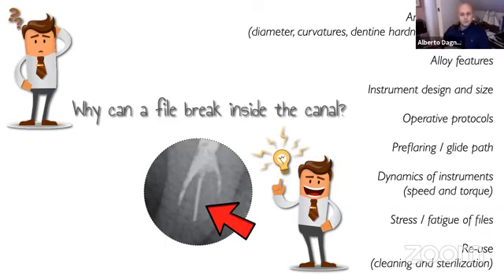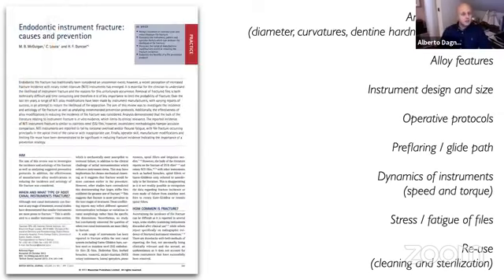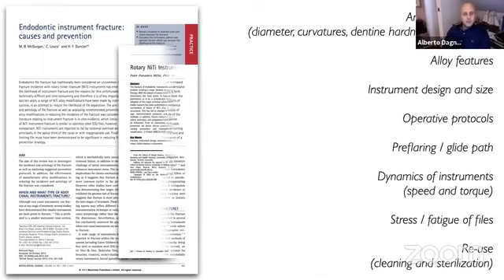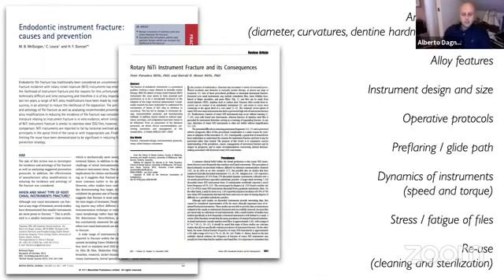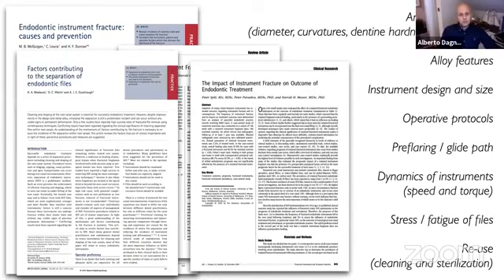we don't want to leave a broken file inside the root canal. So we have to spend much more time to remove it or to bypass it according to the clinical situation. And we have lots and lots of articles in literature regarding the fracture, the causes, the analysis of the etiology of the fracture inside the root canal, and the strategies to prevent it in order to favor the best result for each one in endodontic therapy.